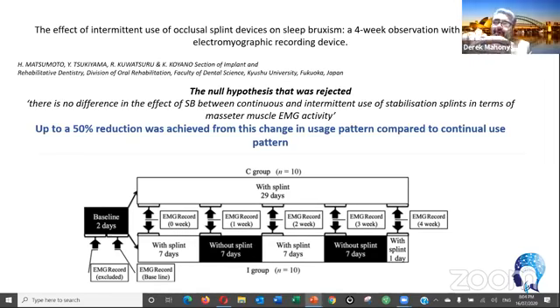Now look at this. Look at those little babies. They're resin printed as well, aren't they? That's a much better wing that you put on that. Yeah, they're the same material, exactly the same. But what works even better, when I remember to use it, is your lip shield. So what I do is I put this in, I put the lip seal in, and I can feel my tongue hit my palate, and correct me if I'm wrong, but I get much better nasal breathing out of that. So I think lip seal is what everyone is forgetting in any appliance.